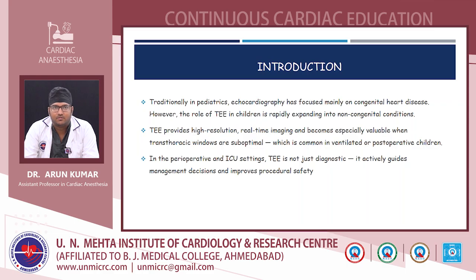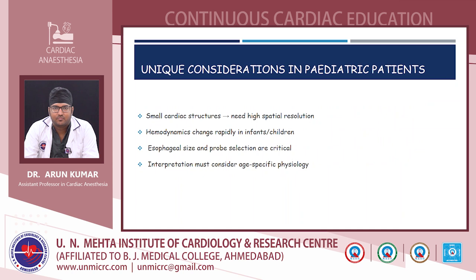ventilated or post-operative children. In the perioperative and ICU setting, TE is not just diagnostic, it actively guides management decisions and improves procedural safety. Some unique considerations in pediatric patients when it comes to TE. First, the cardiac structures are very small and it requires high spatial resolution and careful probe selection. And pediatric hemodynamics are highly preload sensitive and can change very rapidly. And interpretation must always be age appropriate because normal values differ significantly from adults.